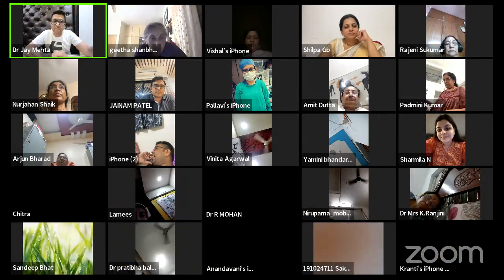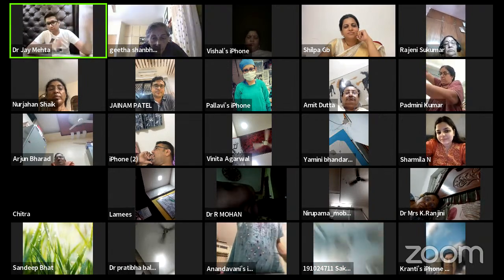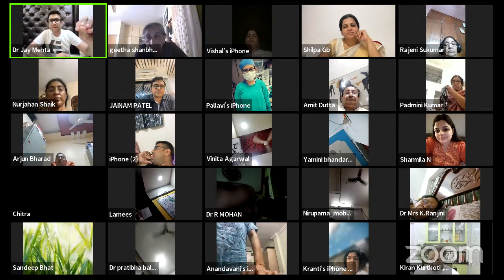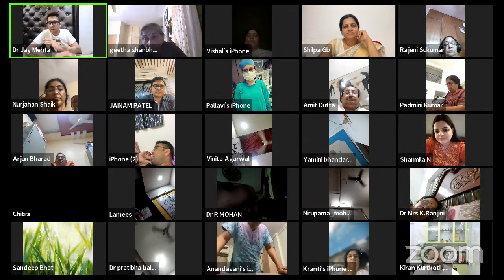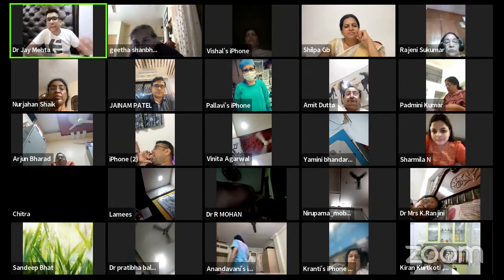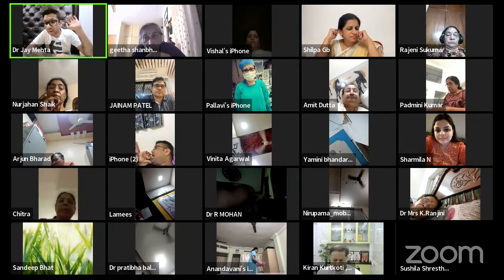Better is to counsel the patient for laparoscopy. We don't even tell the patient, the air bubble test was there, congratulations, your tubes are open. Rubbish. If the air bubble test is positive, it does not guarantee that the tube is open. It could be a perforated tube also. It could be intravasation or extravasation happening from somewhere, which is causing that bubble to come out.